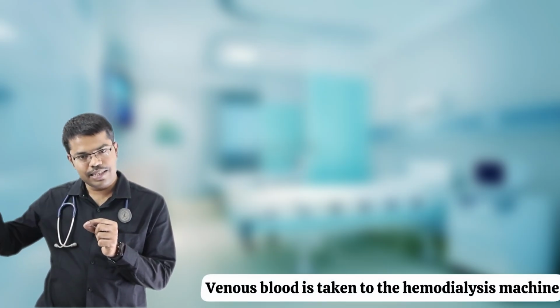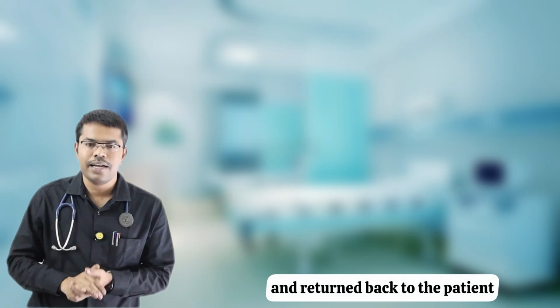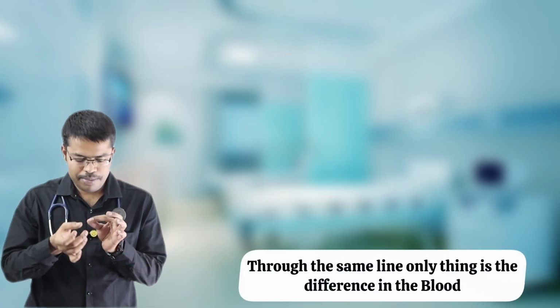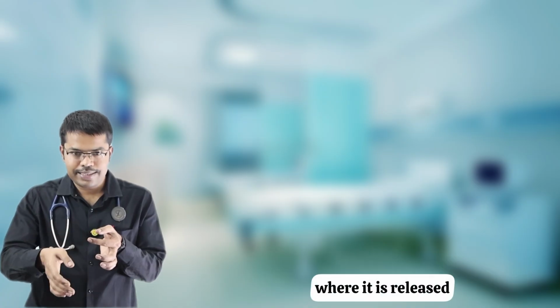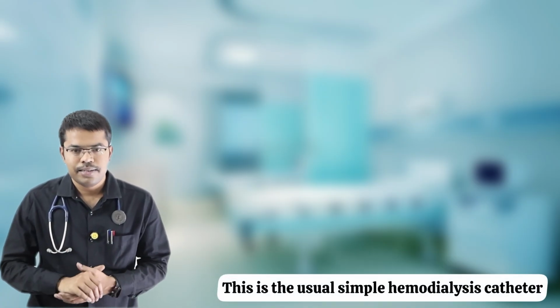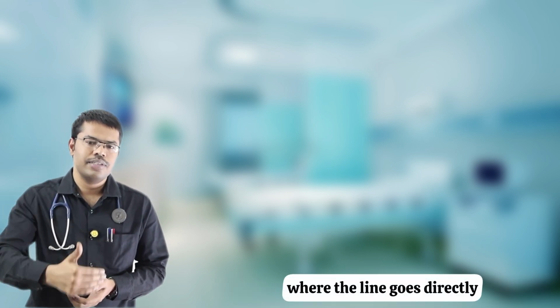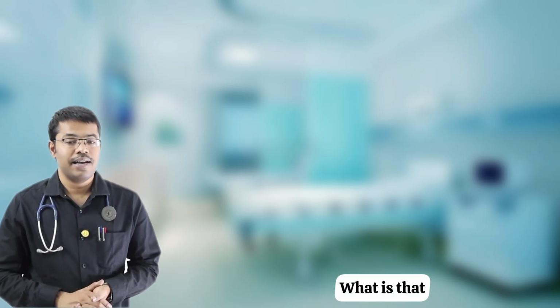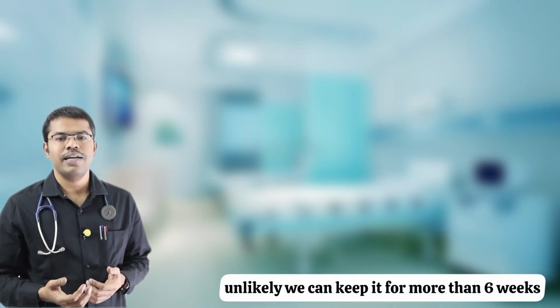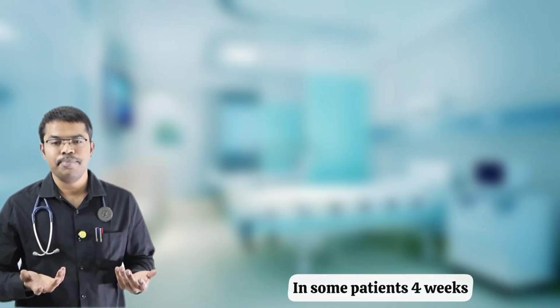Venous blood is taken to the hemodialysis machine and returned back to the patient through the same line. The only difference is where the blood is released, at the tip and the side. This is the usual simple hemodialysis catheter where the line goes directly. But there is a disadvantage. What is that? The time limit. That catheter, we can hardly keep it for more than 6 weeks. In some patients, 4 weeks.